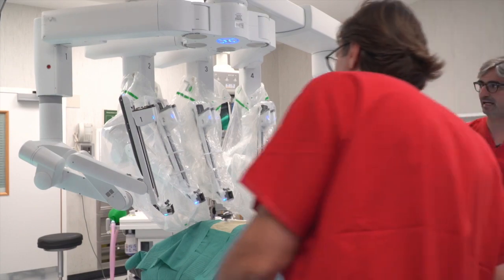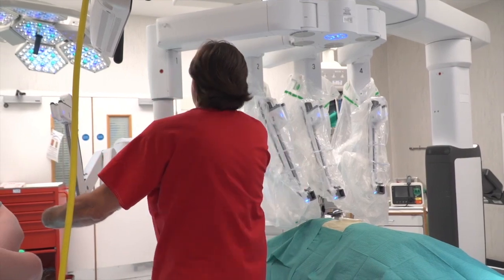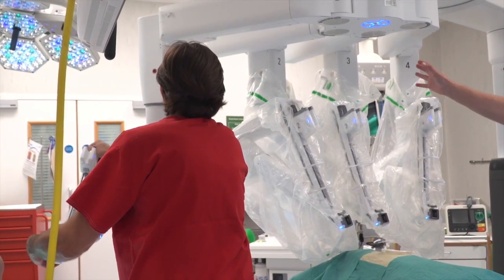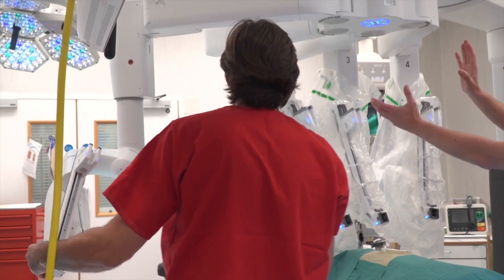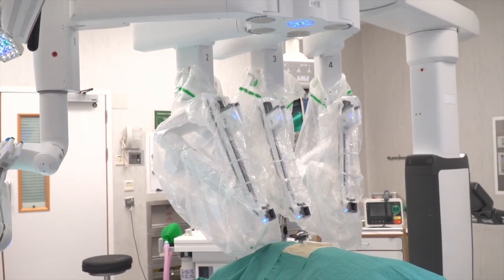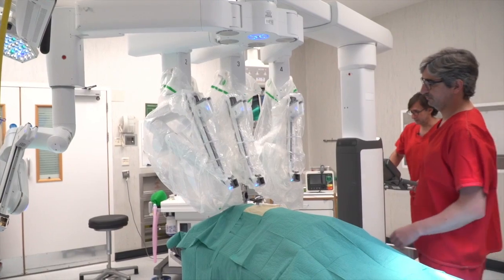Mugur, you can explain. We always have this vertical, but we can rotate a little bit more. Yes, you can explain. We can rotate a little bit more the boom.